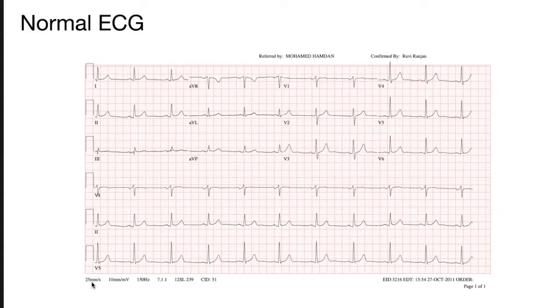So with these 2 pieces of information, as well as looking at the ECG itself, how would you guys go about calculating the heart rate? It's a simple conversion that all should have learned from fundies. Conversions never go away. So does anybody have any idea how to use these three things together to calculate heart rate? A quick question that will help me understand that question more, and this might be dumb, but we have them listed like 1, AVR, V1, V4.